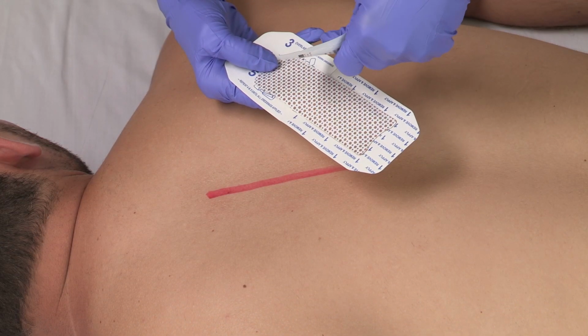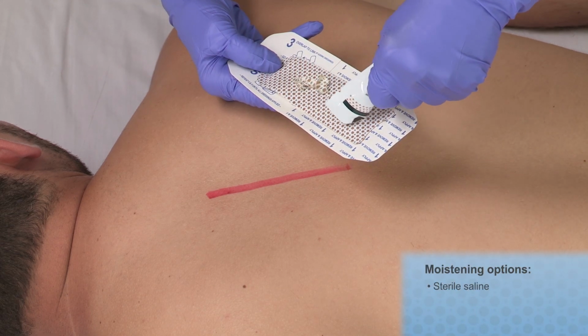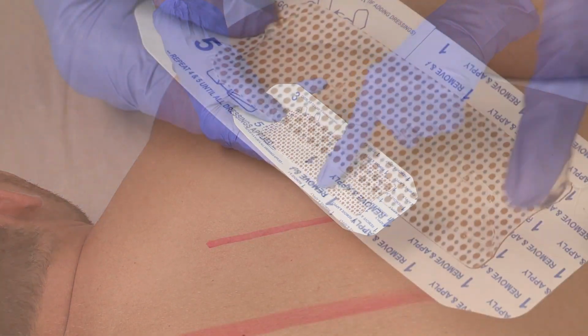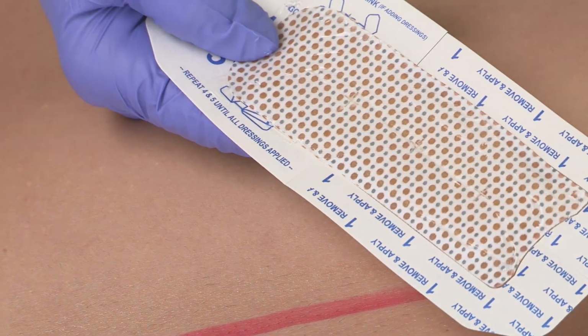To activate Procellera's FlexEFit microcell batteries, moisten the Procellera pad with sterile saline, water, or a thin, even layer of Energel wound hydrogel. Hydrogel will help maintain moisture and battery activation longer than saline or water.